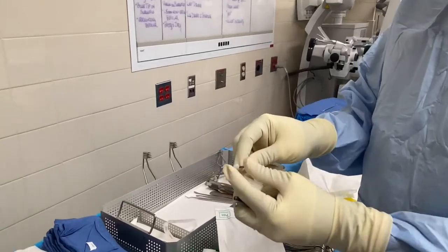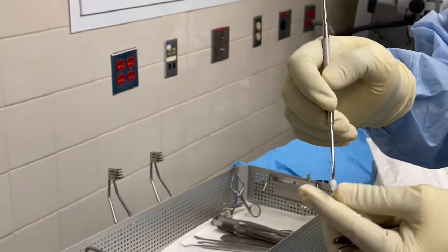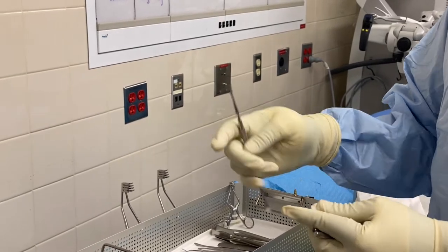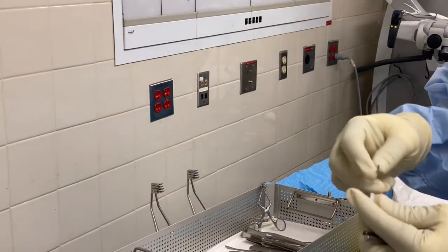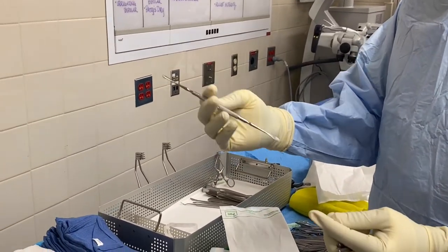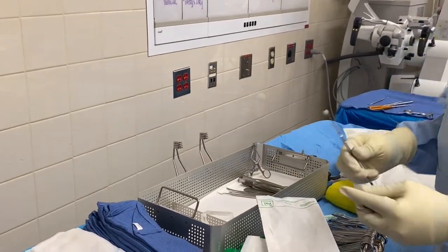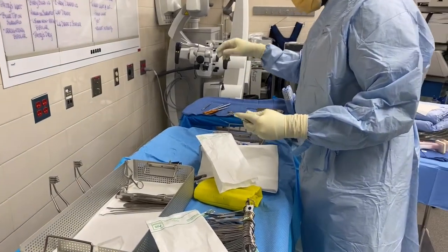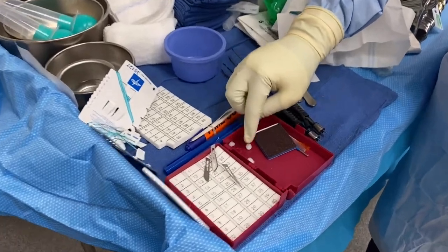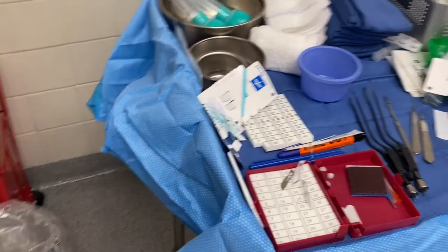Put a small amount of bone wax on the freer, apply it where there's bleeding, spread it around the bone, and it will stop the bleeding. Make sure to put wax on both ends so doctors don't have to keep asking — they can use one end and then the other. Put it next to your patties, and put maybe three or four wax pieces ready on the side.